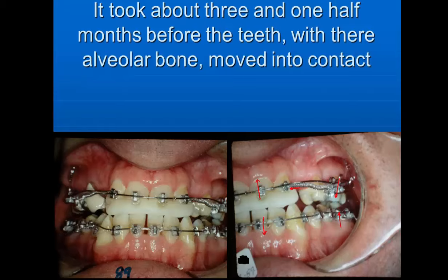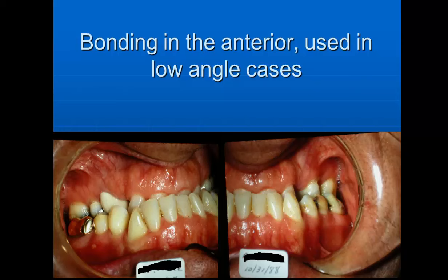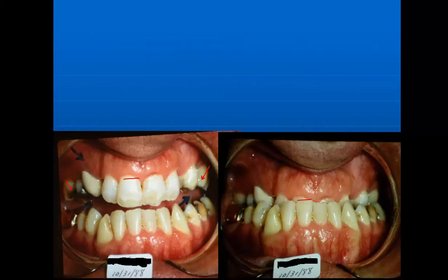Let me go back and then see. Now you see we had to open up this space in here, and we'll open up the space in here, and then we brought these teeth out back in the buccal. And we did that after we opened the bite. In other words, put the bite block on the front. And that allowed you to do that.